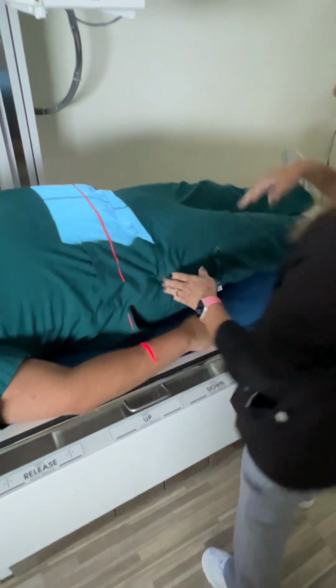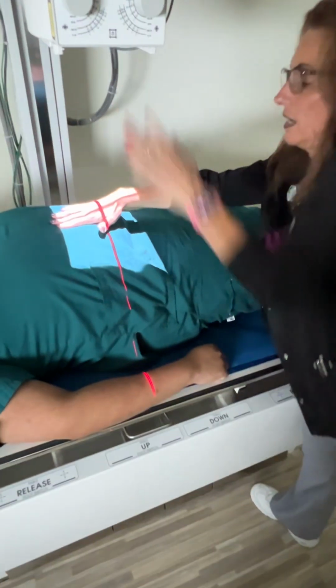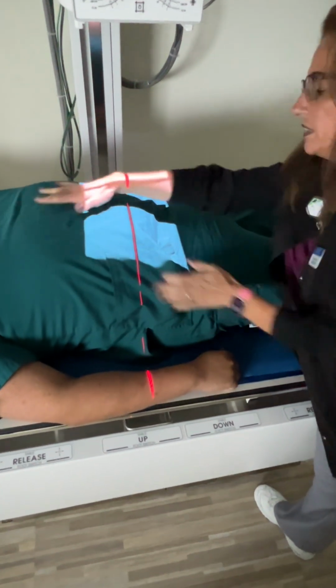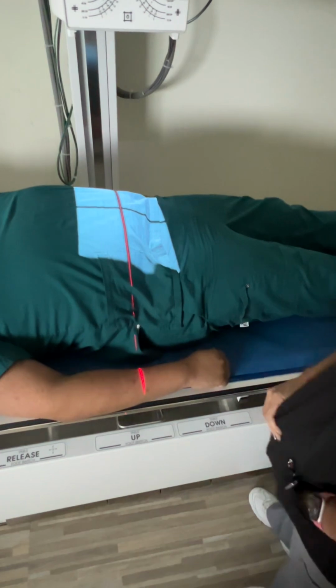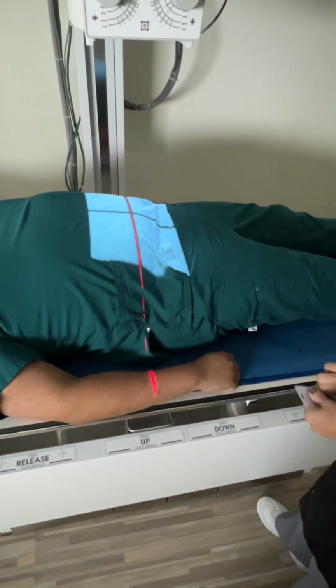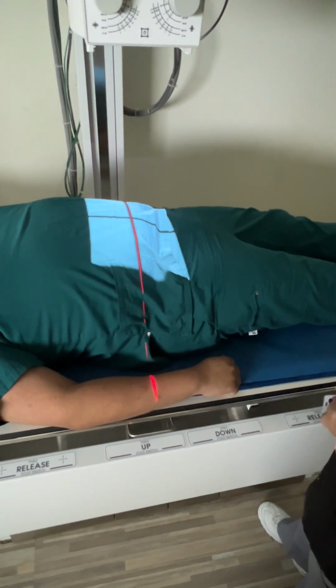I need to capture pubic symphysis. I'm gonna check and make sure I'm centered to him. So I'm midline. That looks good. This will be my bottom image. And all abdomen is done on exhalation so that the diaphragm rises.